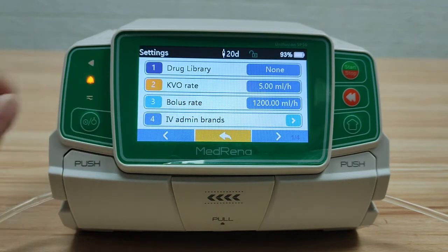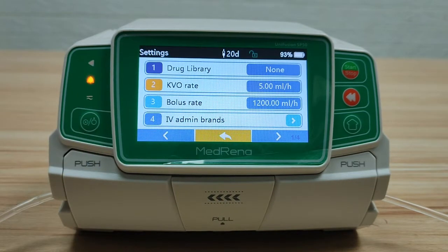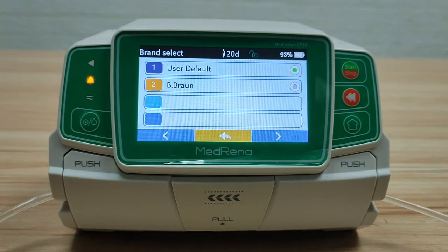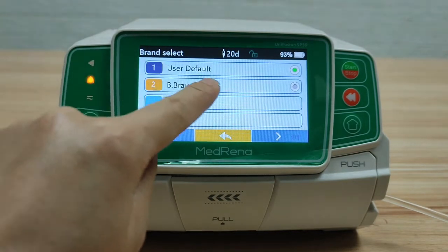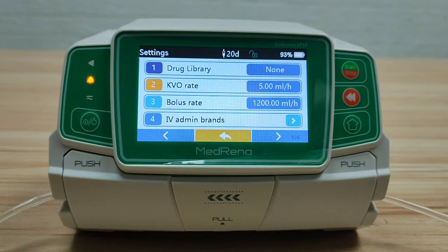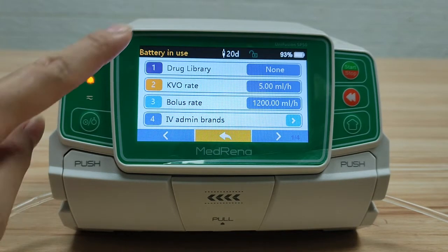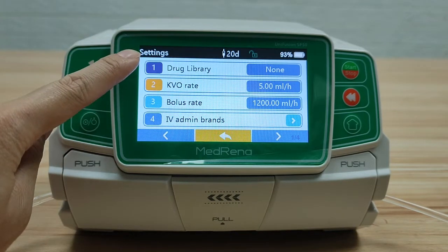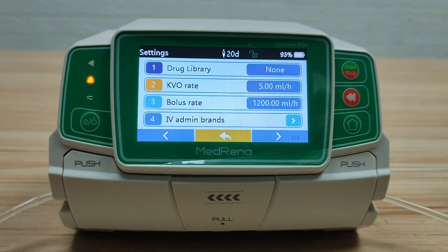IV brands: we can choose the brand of the IV set being used. After choosing, the IV set brand will be shown on the title bar. We can store up to 20 brands of IV set into the system.